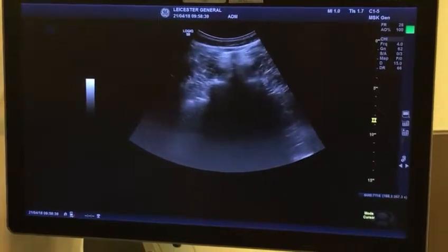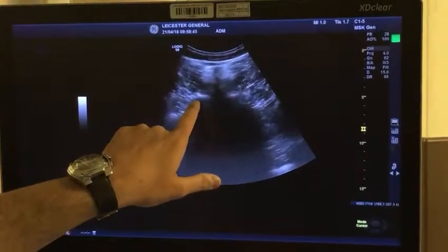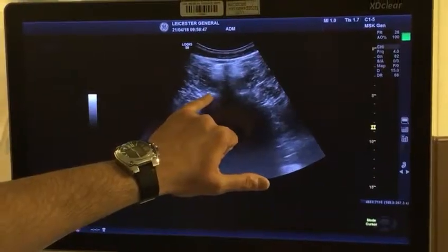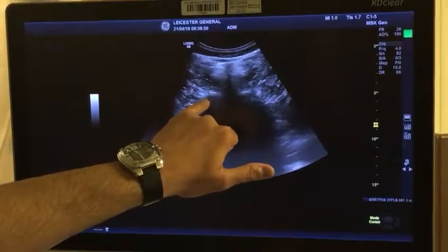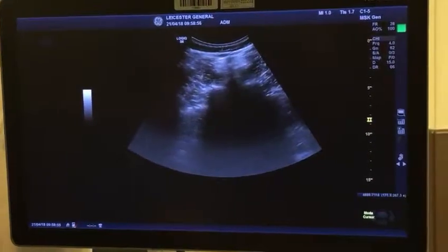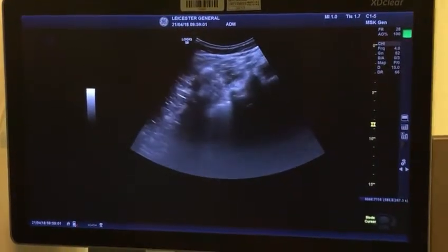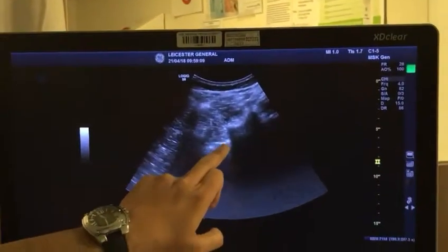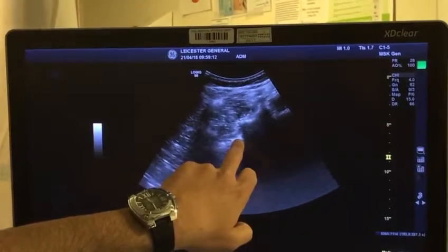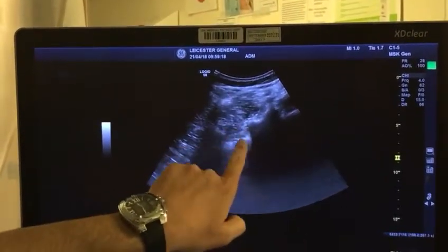Now this is what I call a two-step sign. Step one, step two. Step one is the facet. You've got your superior articular process here, inferior articular process, and that's your facet joint capsule. If you want to do the facet joint injection, I bring that more clearly into this image, turn the probe that way, and bring the needle in plane like that to do the facet joint injection. If I want to do a medial branch block, then that will be my target. That's step 2. That's the transverse process, superior articular process, and that's where I would go.